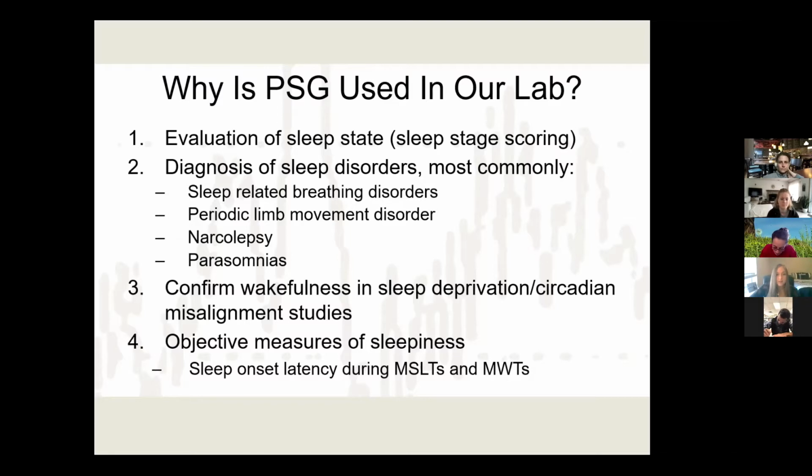And then lastly, objective measures of sleepiness. A month ago, I presented on MSLTs and MWTs. For CTCM, we're going to be using MWTs, and we're really going to be using the PSG for this. We ask them to maintain wakefulness for 20 minutes while lying in bed, and we will be looking at the PSG computers, looking at their brain waves, and looking for a K complex or a sleep spindle. This is indicative that the person fell asleep, and that's when we'll know the test is over. This was their sleep onset latency, and we need to send someone in the room to make sure that they stay awake for the remainder of the 20 minutes.